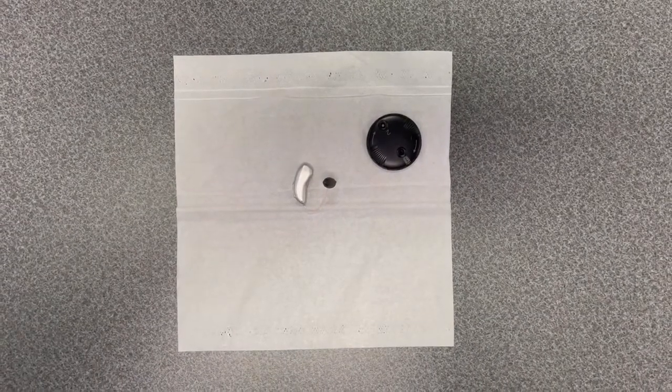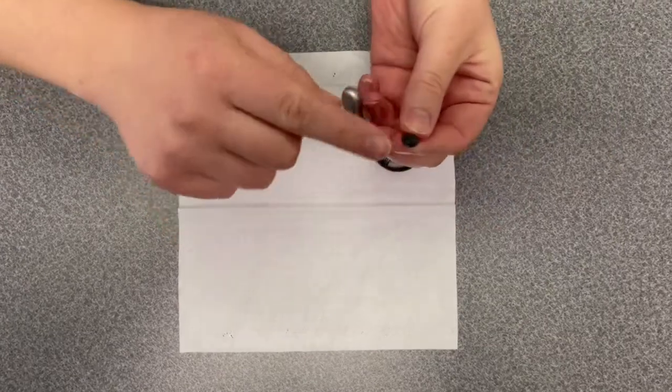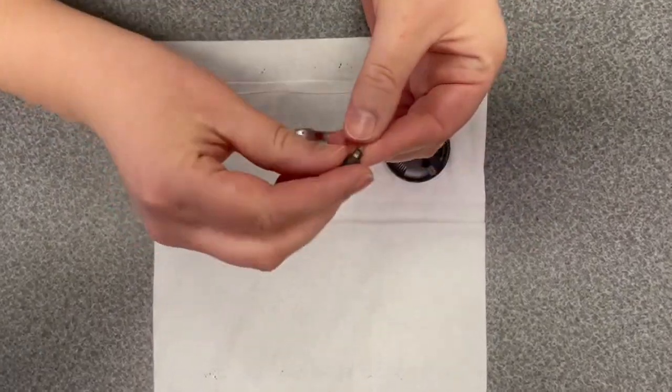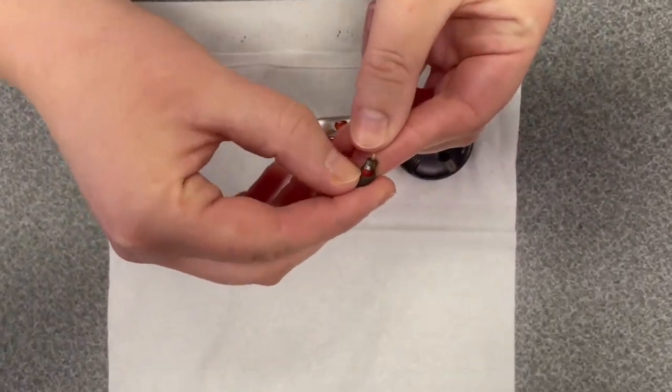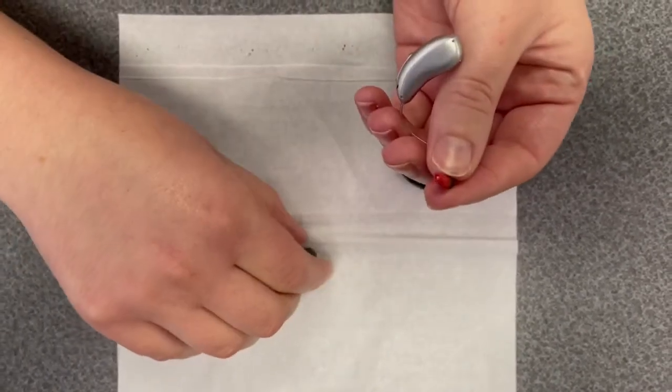To change the dome and the wax guard for a Phonak hearing aid, take the end of the hearing aid that goes in your ear, get your fingernail underneath the dome. You can use a little bit of force, that's okay.